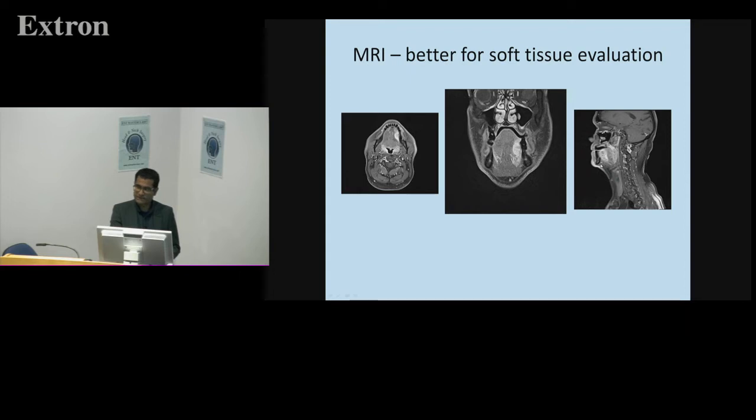Yeah? So often the T side of the TNM staging has changed slightly, looking at oral cavity tumors. They also look at the depth of the tumor now, which wasn't there before. So these images are quite useful for discussion in the MDT.